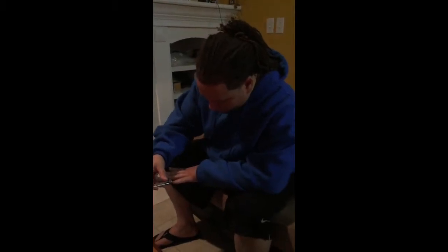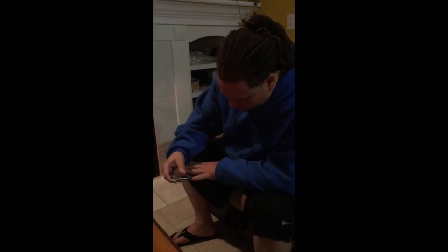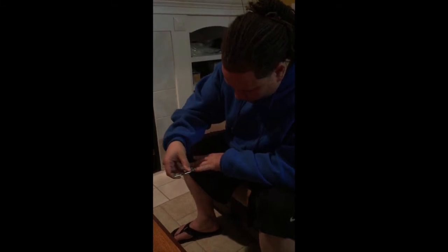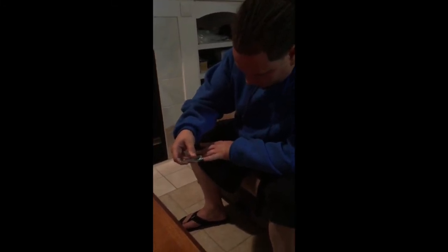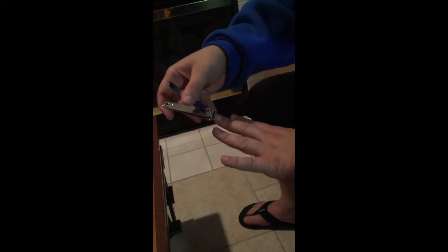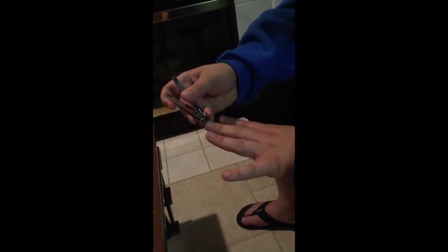This is Raul here. He's demonstrating how he would use a nail clipper if he had regular use of his hands as far as fine motor strength. As you can see, cutting your nails requires fine motor strength to flex your PIP and MP joints. There's a little bit of wrist ulnar deviation and definitely a pincer grasp. Now Raul's going to switch over to our adaptive nail clipper here.